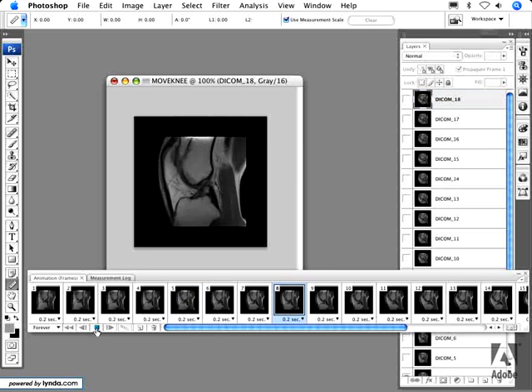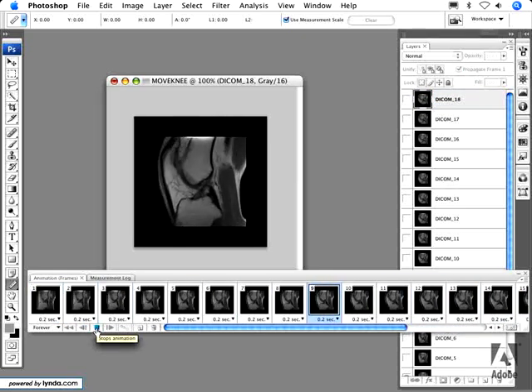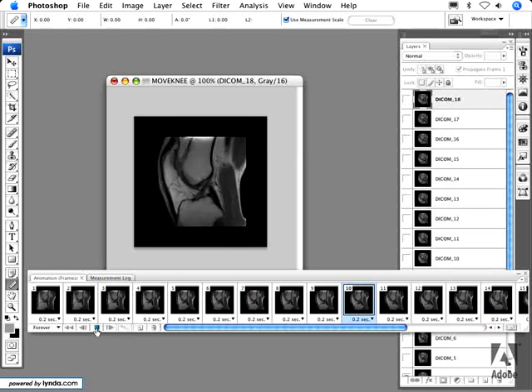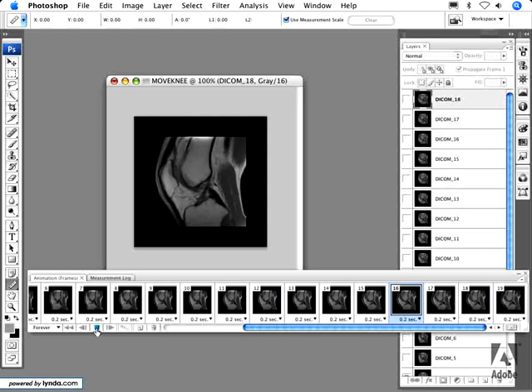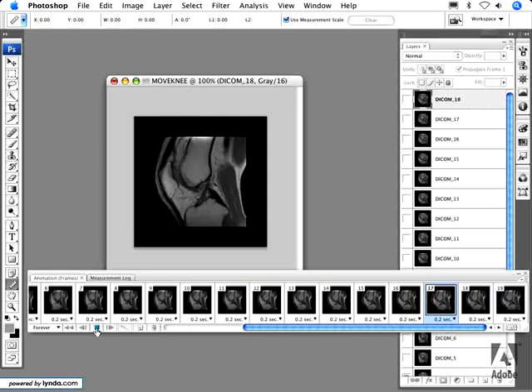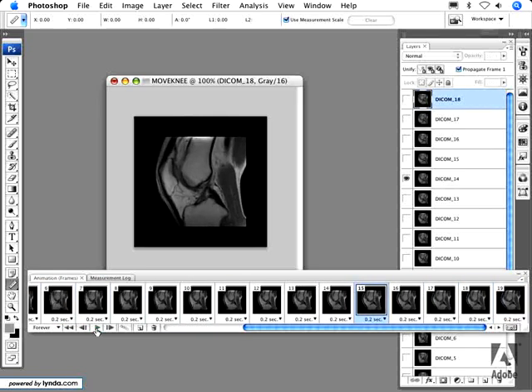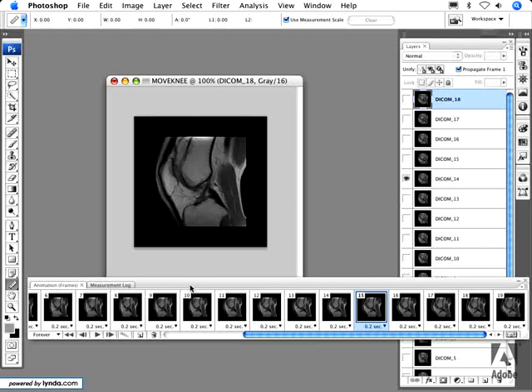This is a really useful feature for people who are taking time-series images and wanting to show them in an animation. You can export this as an AVI file, an MPEG file, or even a GIF file for use in presentations, on the web, or for other purposes. That covers how to get DICOM images into Photoshop, how to export them, and some interesting things you can do with them.